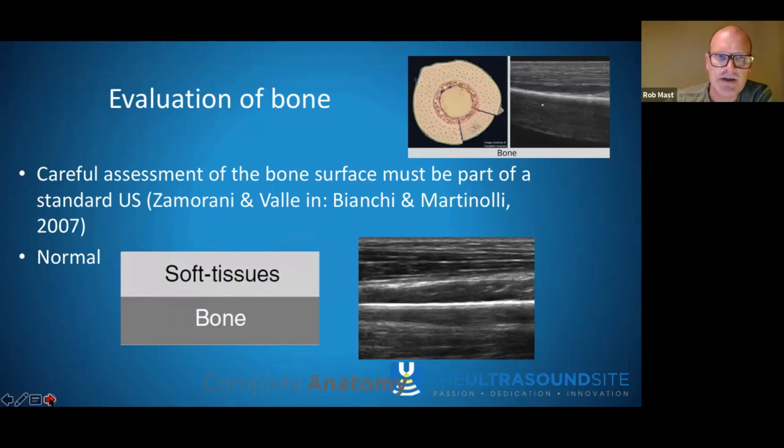that overlie it. And if any ultrasound wave goes through tissues of two very opposing densities, then it creates this very, very sharp, bright white line. And that's why, if you're scanning a bone, the bone will always be very, very bright.